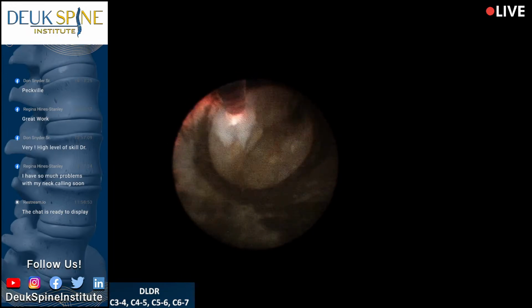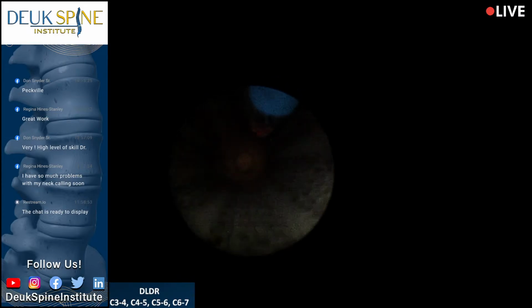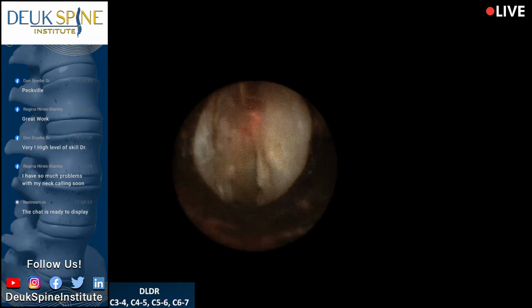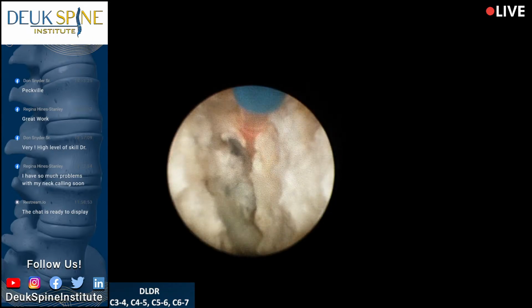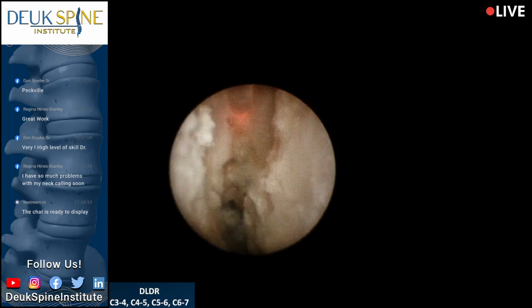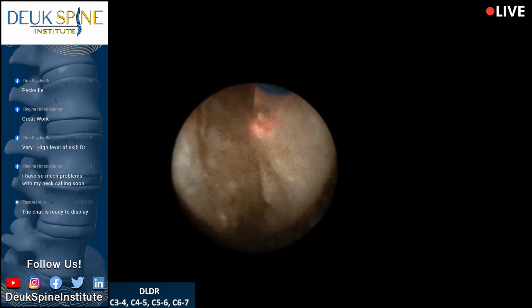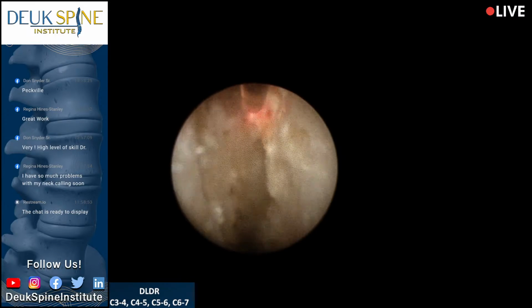All right, I'm happy with that foramen. And I'm going to head back my way. This is endoscopic surgery, in case you're wondering. And unfortunately, I'm the only one in the United States that does it. There is a Dr. Joe, but he does very different. He goes through a foramen. I go through the disc. We call this transdiscal. Trans means across or through.